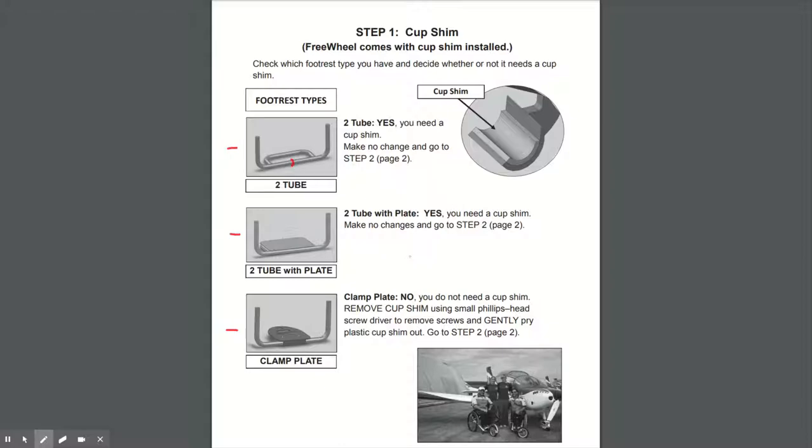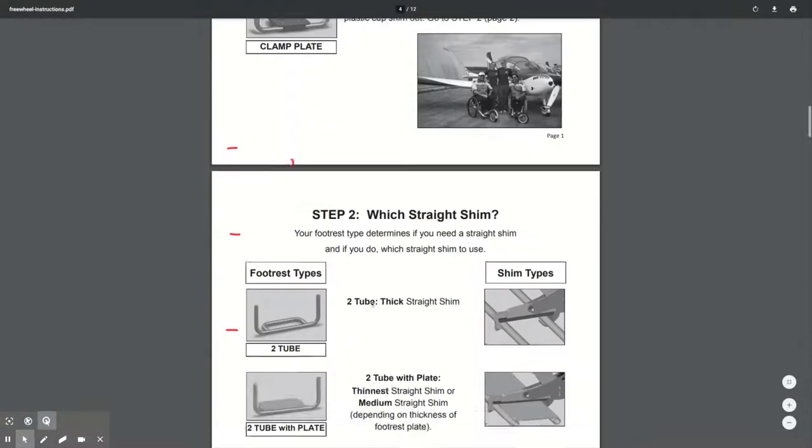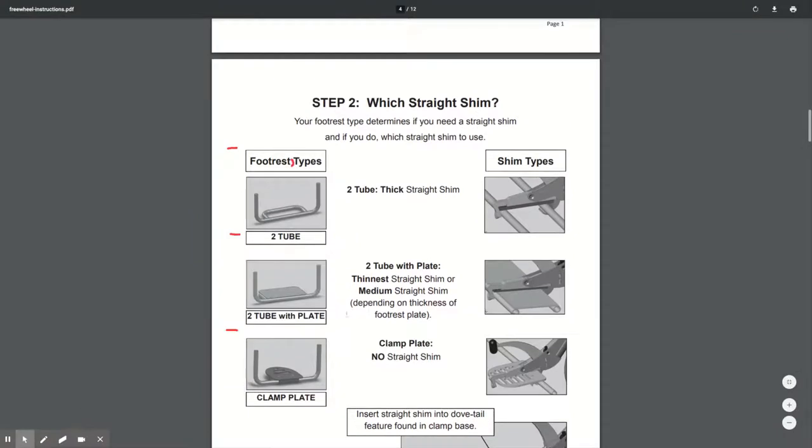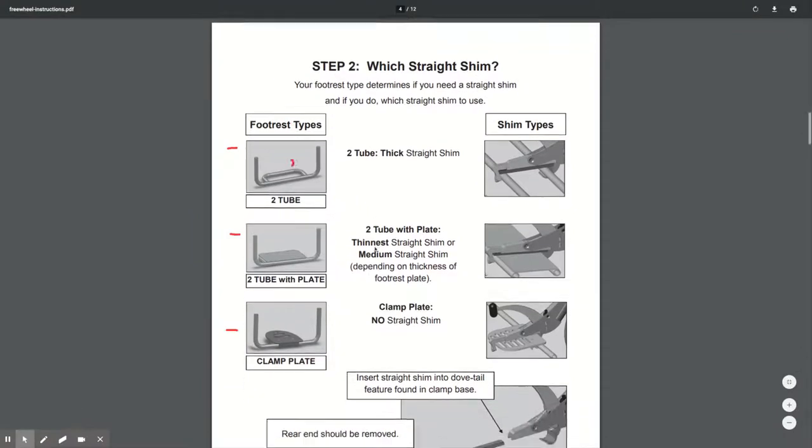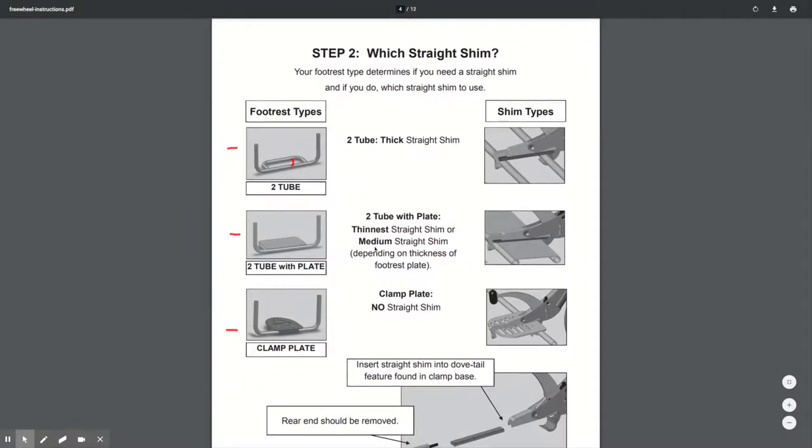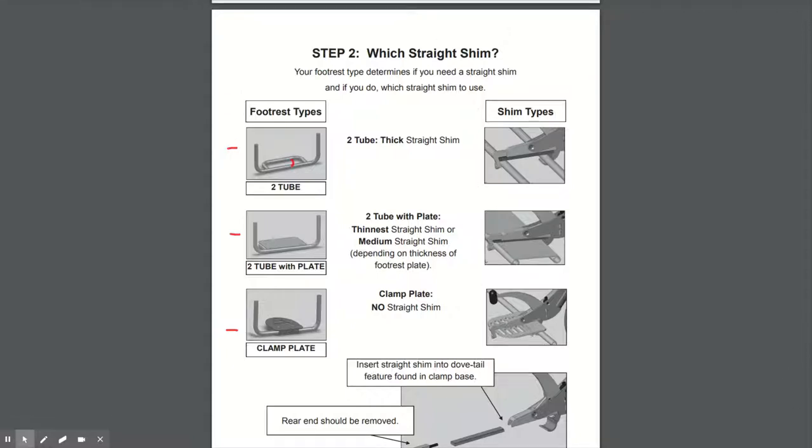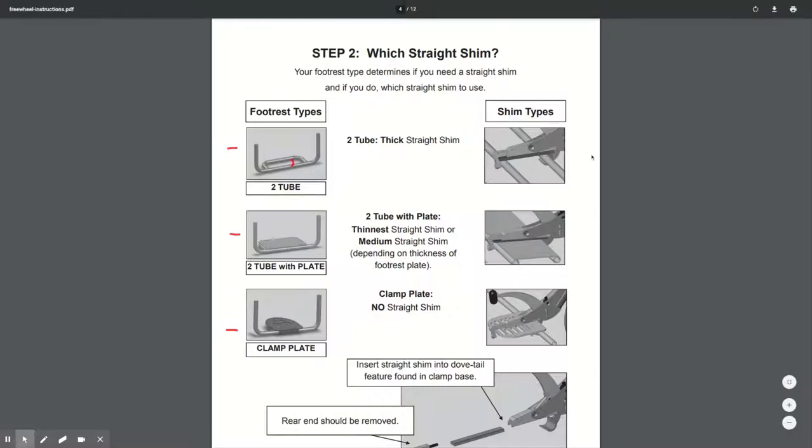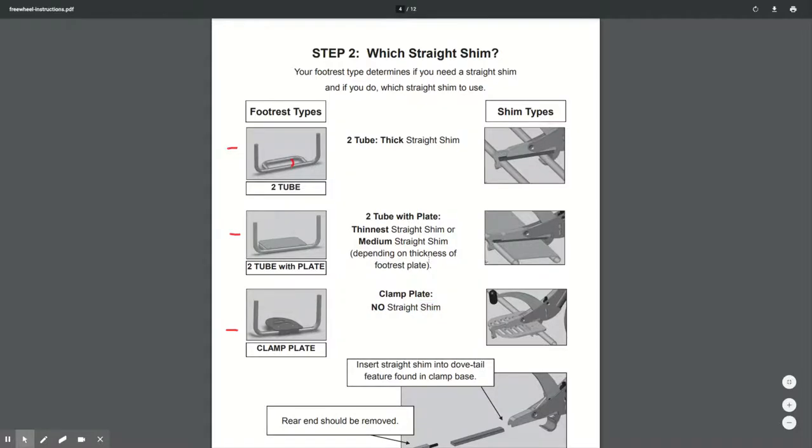The next step is whether you need the straight shim, and whether you need the thick, medium or thin. Again, it depends on your footrest type. If you've got no plate, then you need the thick shim. If you have a plate, then you need the thinnest or the medium, depending on the thickness of your plate. And if you've got a clamp plate like this, then you need no straight shim.